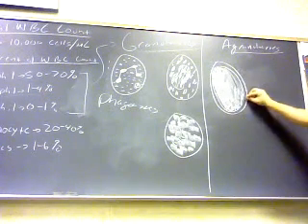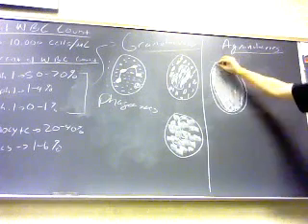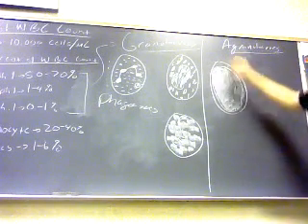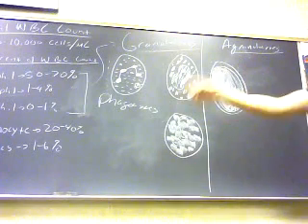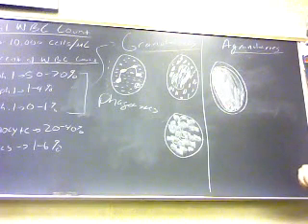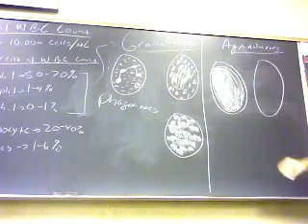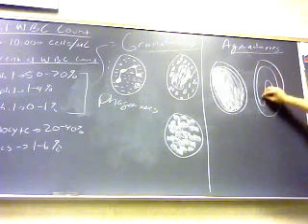Again, these do actually have some very fine granules in the cytoplasm, but like I said, they're not significant enough to really mention. So that's lymphocytes. Their nucleus is quite conspicuous, and like I said, these make up 20 to 40% of the circulating white blood cells that you find in the blood. And last but not least are monocytes. Monocytes have a very large horseshoe-shaped nucleus.